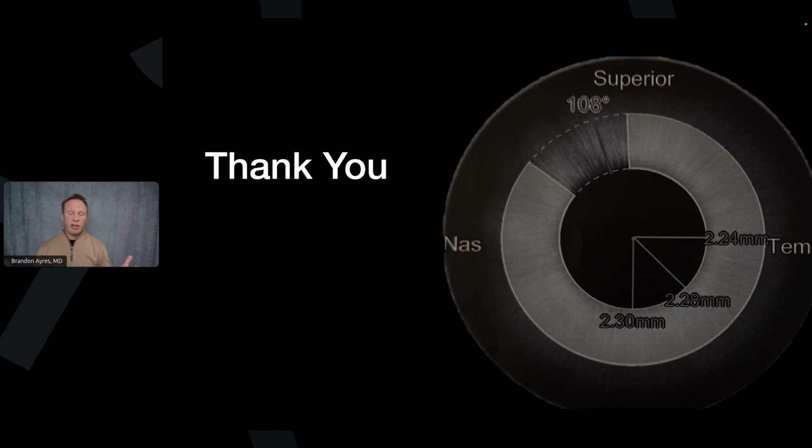Yeah, so a couple of questions are often asked when it comes to cross-linking and CTAK. I will say that I don't really think it's any harder to do CTAK on somebody who's been cross-linked versus not. The cornea is not that much different. It doesn't make things more challenging.